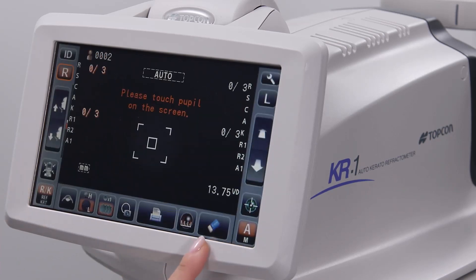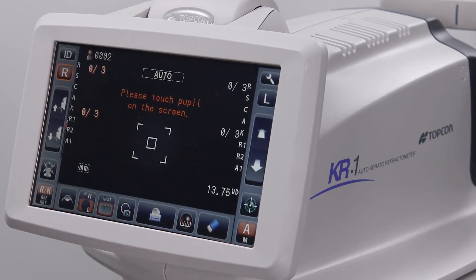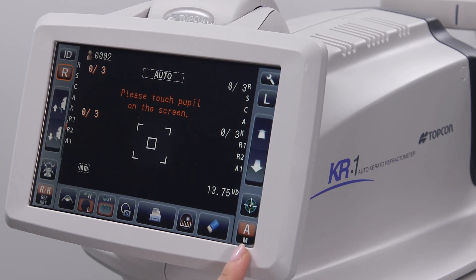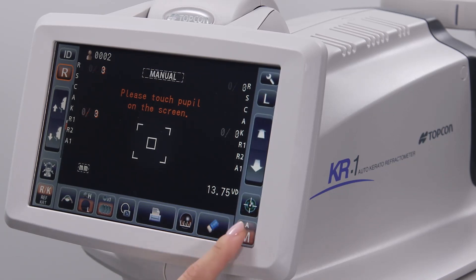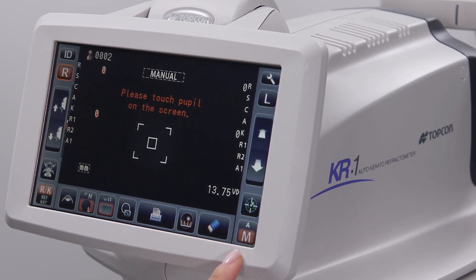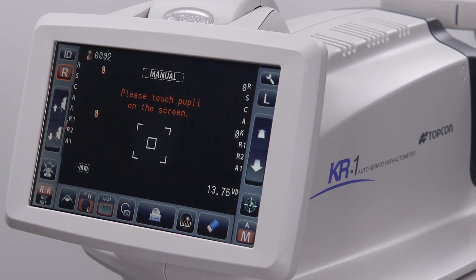The eraser icon deletes all of the data that was acquired on the previous patient. The alignment icon allows the operator to switch between automatic and manual modes. In manual mode, the operator will need to tap the pupil to center it and then manually focus the eye.